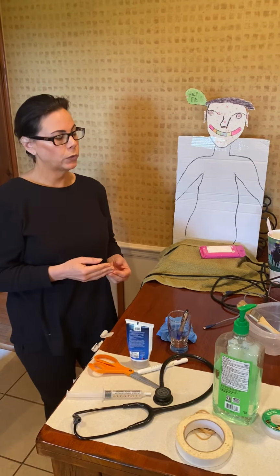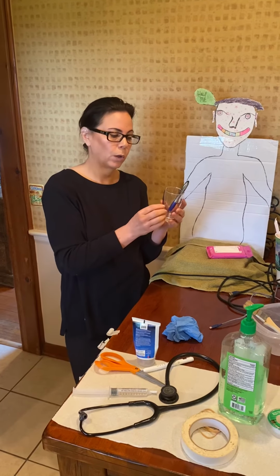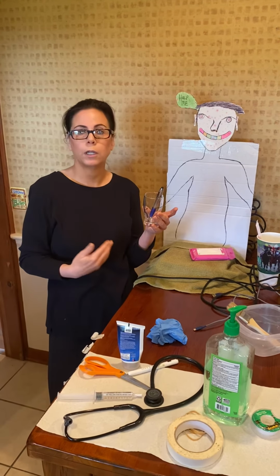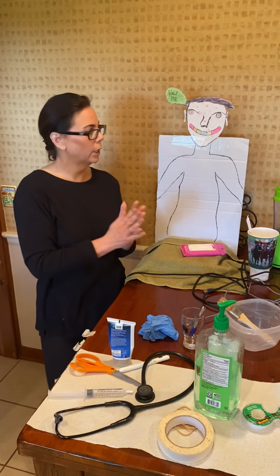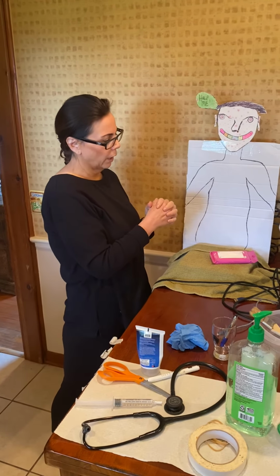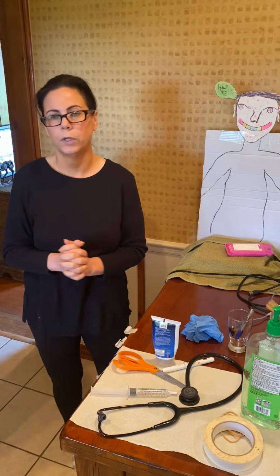I'm going to also document that the placement was confirmed by x-ray. I am going to document what we saw here, the pH being 3, and the consistency and color of what came up. And I would wash my hands, provide for privacy, and ask my patient again, Mr. Smith, do you need anything? He's good. And I would come back in a few minutes and check on him. And that concludes part 1 of NG tube insertion.